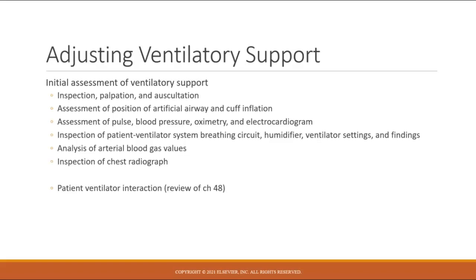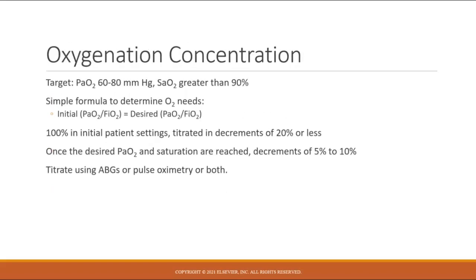We talked about in the first week, we revisited some patient ventilator interactions and how those interactions change your waveforms. There's a more in-depth review of that in chapter 48, which we had covered last week, or the week before, excuse me.